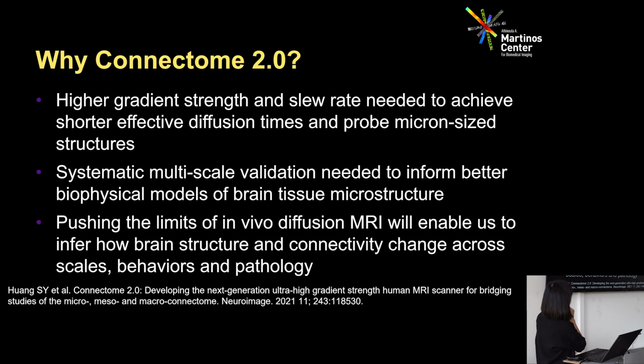And then finally, to figure out how that structure is changing in pathology and potentially to develop earlier biomarkers of neurodegeneration, for example in the brain, diseases like Alzheimer's disease, which we spoke about yesterday in our Meditech circle. Typical ways that you diagnose neurodegeneration in radiology are you look for tissue loss, tissue shrinkage. But by the time the tissue is lost, there's really nothing you can do. And so being able to identify these pathological processes earlier on, potentially at the tissue level, may allow us to intervene earlier and actually affect the disease course.